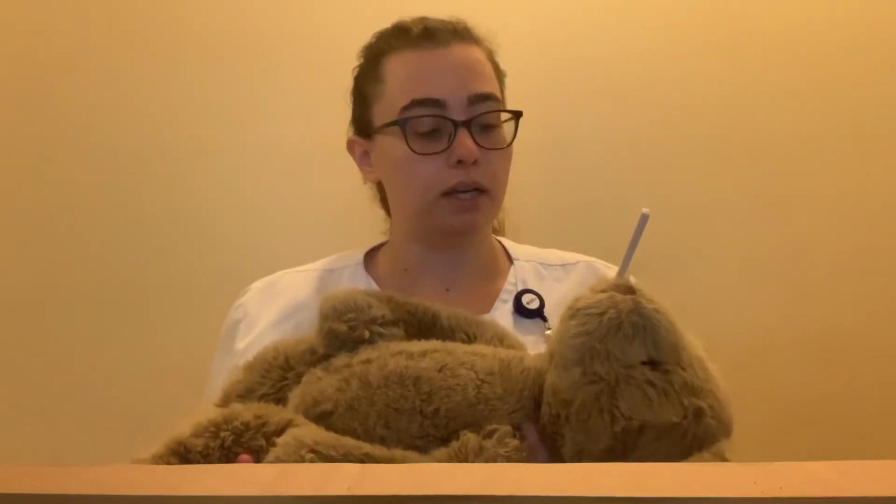You are going to position the patient on their side and with their head down. The reason we put them in this position is to help prevent aspiration, which is the most common complication. I forgot to mention, when you insert the OG tube, you must be gentle and insert it slowly because you do not want to cause esophageal perforation. This is another complication.